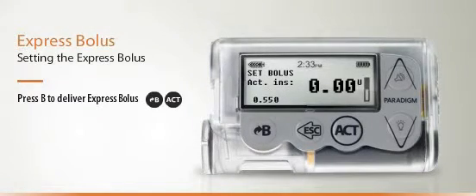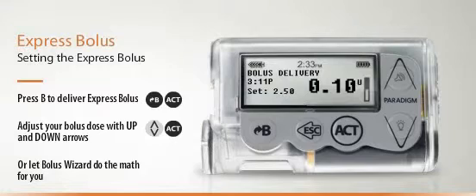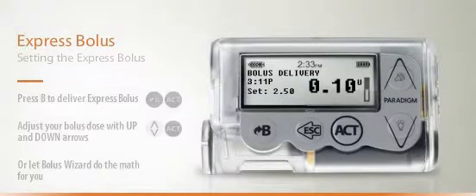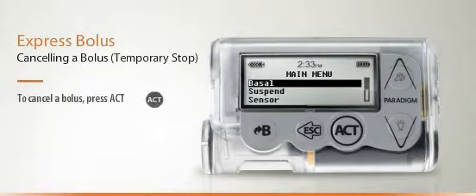If you are not using the bolus wizard, use the up and down arrows to adjust your bolus, then press Act. If you are using the bolus wizard, it will give you a helping hand by suggesting an appropriate bolus using your preset information. Should you decide to cancel a bolus in the middle of a bolus delivery, you can do so by pressing the Act button.